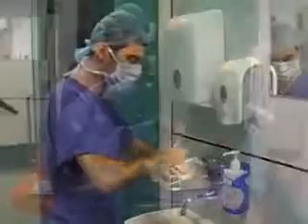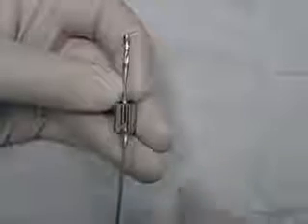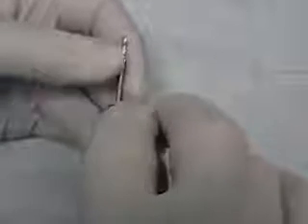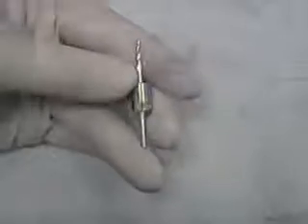Put on a face shield. Wash and disinfect your hands and don a sterile gown and sterile gloves. If you are using a drill guide, loosen the guide with a hex wrench. Place it at a suitable depth, typically approximately 20 mm, and then retighten it. Thick skull and scalp hematomas may obviate the need for a drill guide.